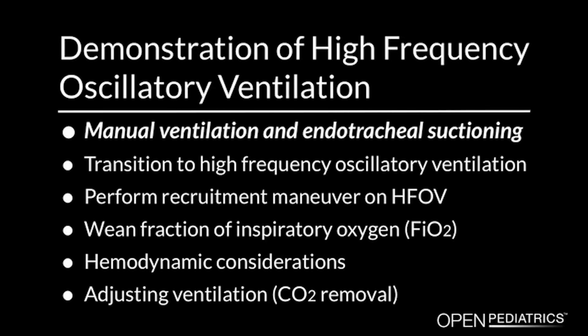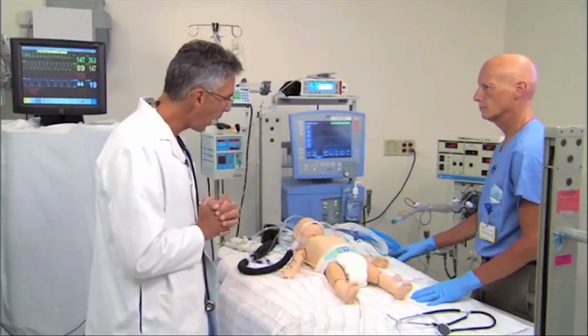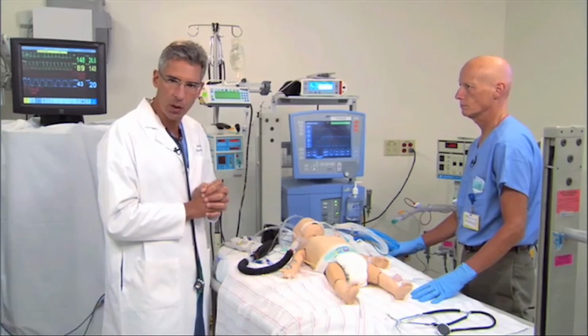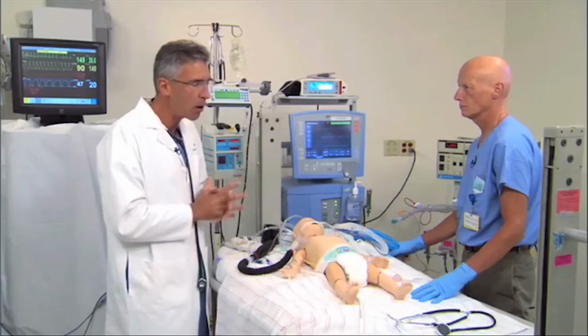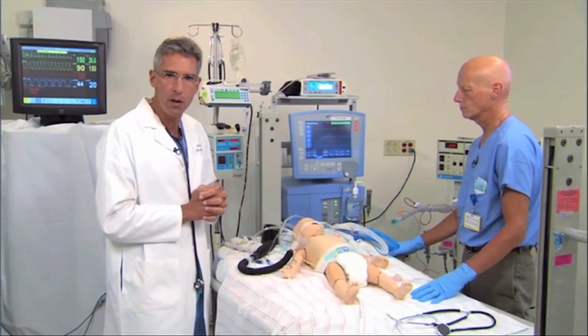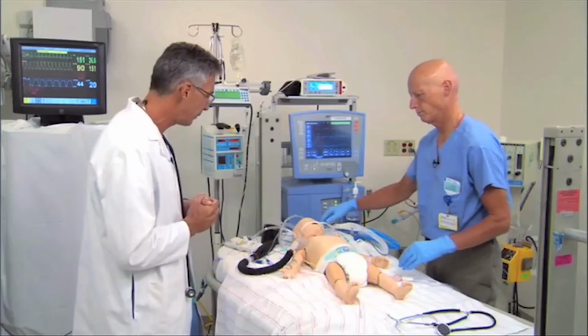Manual ventilation and endotracheal suctioning. Now, the next important step, I think, is to manually ventilate the patient and perform endotracheal suctioning. And as Barry and I do this, we're going to share with you some of the tricks that we've learned over the years and how to do that safely. So Barry, let's go ahead and prepare to suction Samantha.